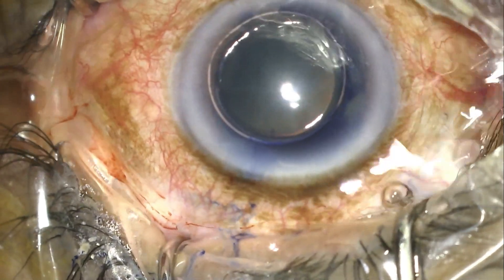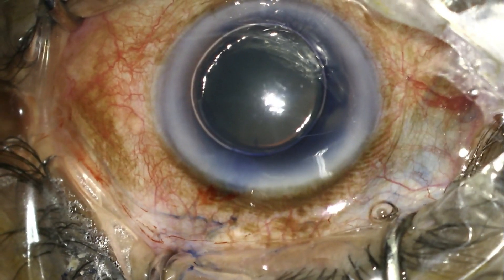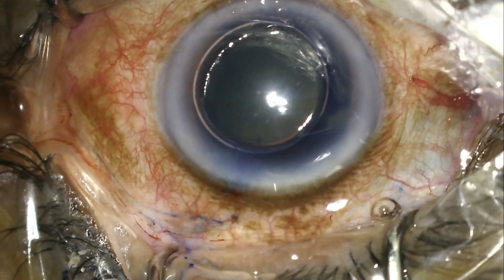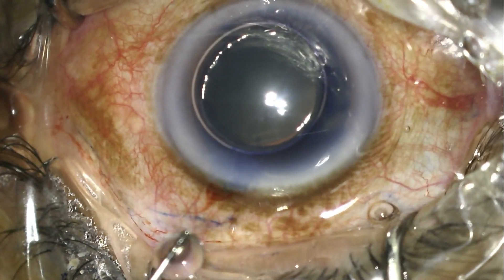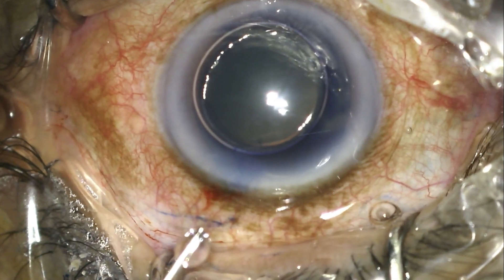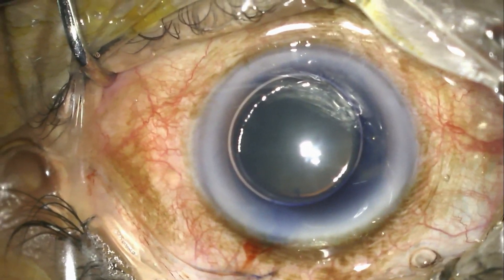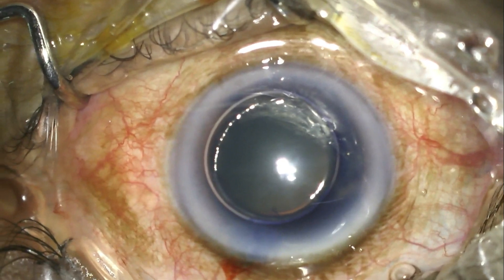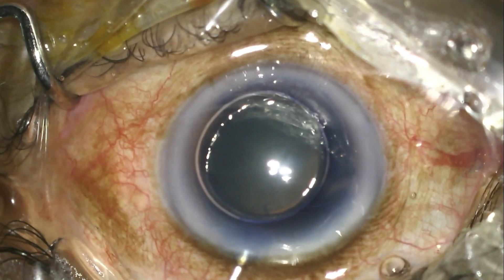This part of the video is unedited, and you can see that the dye can be retained in the anterior chamber for up to about 20 to 30 seconds, which is generally adequate to uniformly stain the anterior capsule. Once stained, the surgeon then gently washes out the blue dye with a little bit of Ringer's lactate fluid.